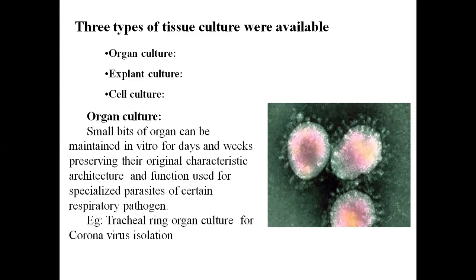Here, small bits of organ can be maintained in vitro. In vitro means laboratory condition, right? Small bits of organ, see, if it is a liver or lung or kidney, whatever. Small bits of the organ can be maintained in the laboratory condition for days or weeks.